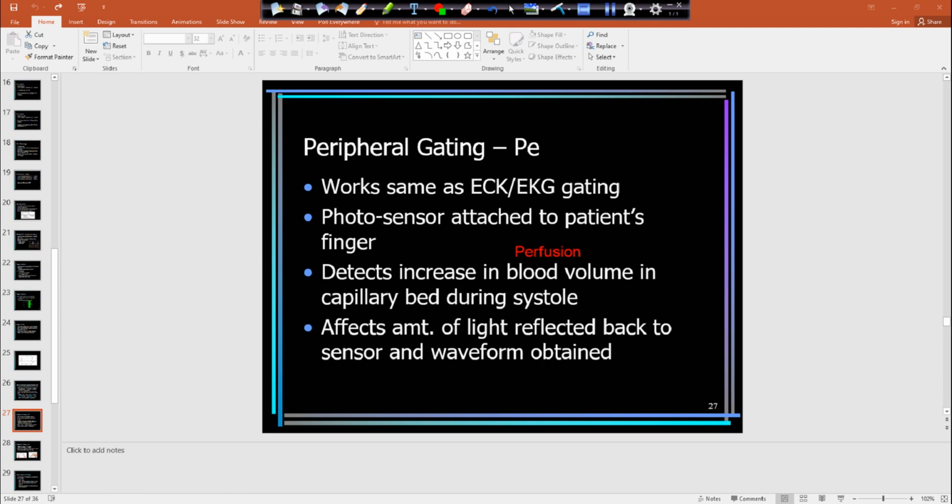The radiologist looks at this color mapping of how well the different tissues in the brain get blood and how fast they get the blood. So if you have some kind of restriction, it might not be red, it might be a blue color. Those colors indicate different things. We'll go over that with our functional MRI.